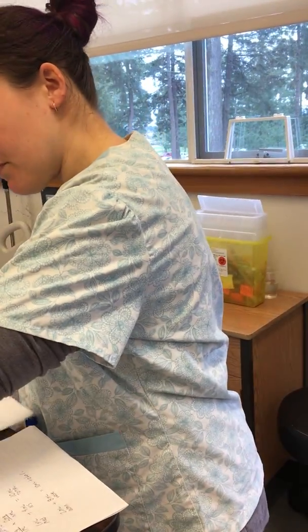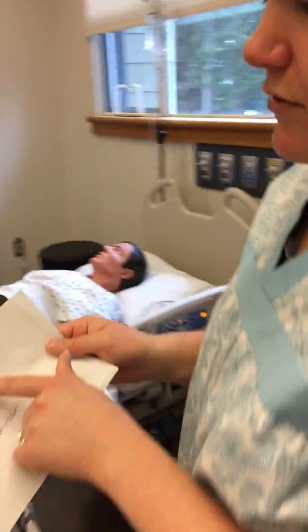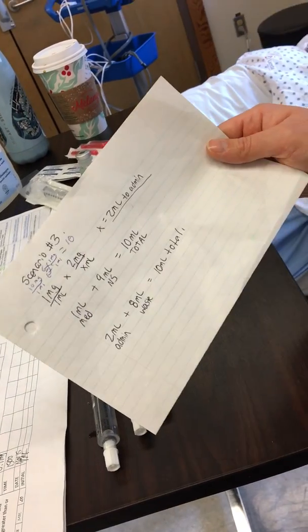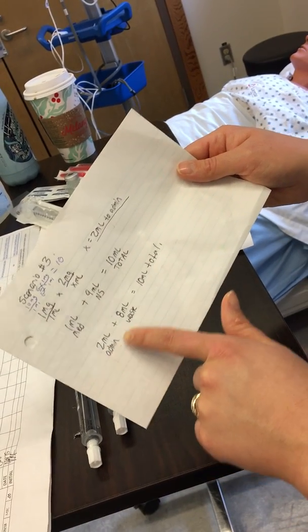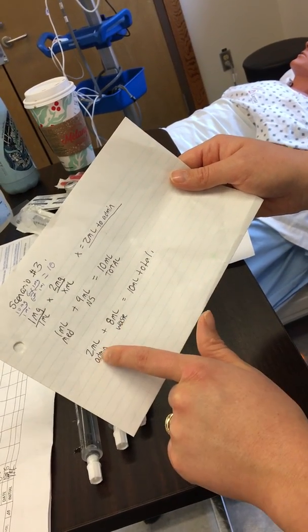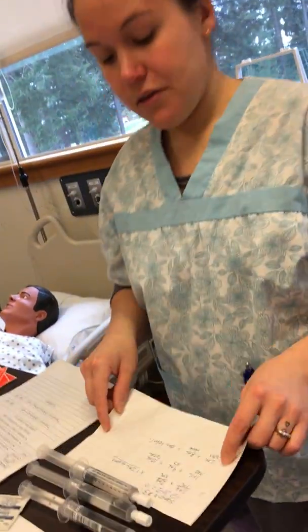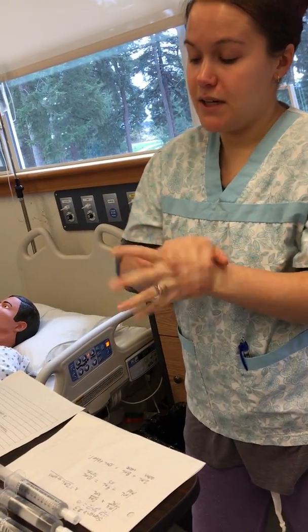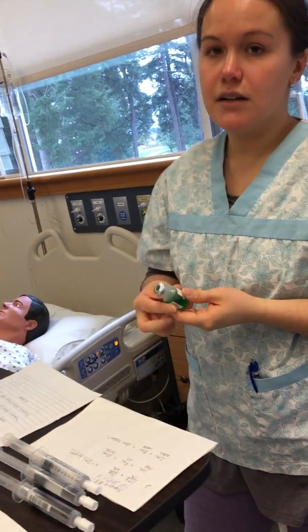Good. So then I do my math to see that the 2 milligrams is going to be in 2 milliliters. That's what I'm going to administer. So I mix it with 9 milliliters normal saline, and then I'm going to waste 8 milliliters and give 2 milliliters. So I get another nurse to check my math, and then I perform hand hygiene so that I can grab my medication and prepare it. So I take my medication out of the Omnicell.